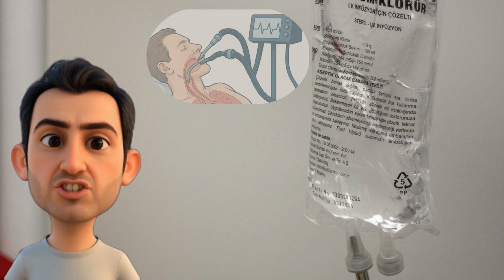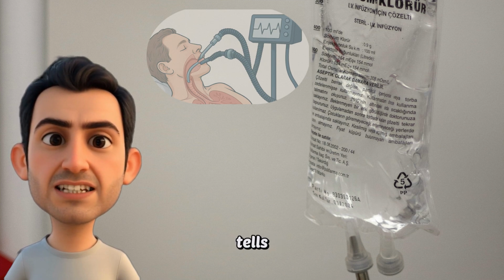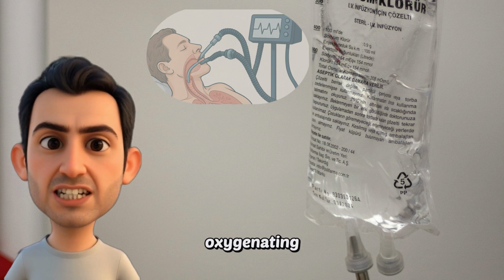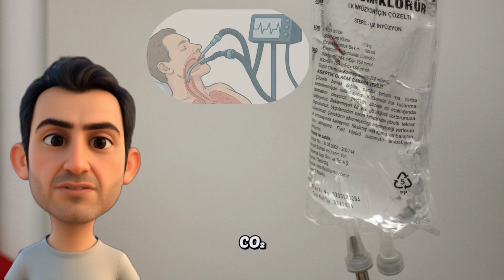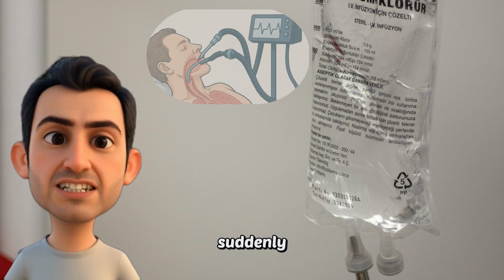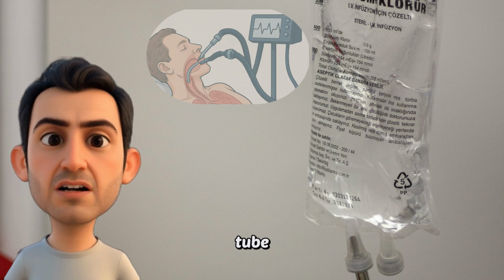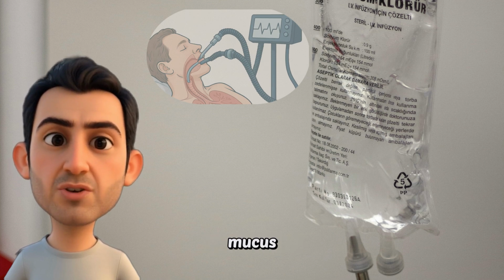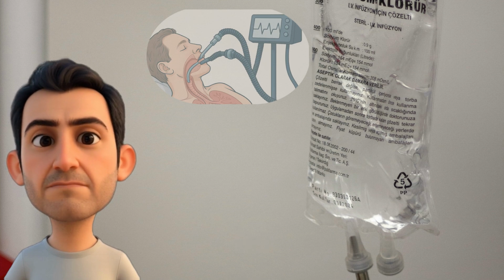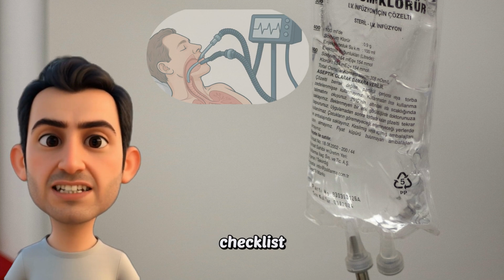Step 4, don't just walk away. After about 20 to 30 minutes, check an ABG. That tells you how well you're ventilating and oxygenating. Also look at end-tidal CO2 and match it to the arterial PaCO2. Now what if your patient suddenly drops? Run through DOPE. D, displacement of the tube. O, obstruction, like mucus plugging or biting the tube. P, pneumothorax. E, equipment failure. Always have that checklist in your head.